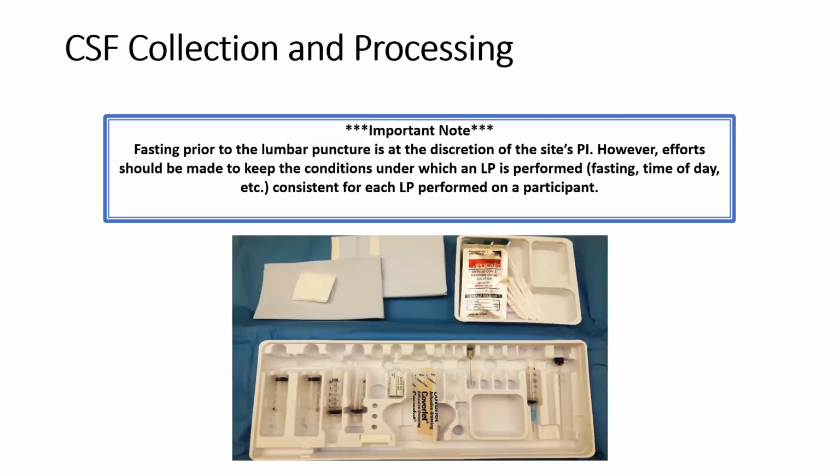For CSF, it's an important note before we get started that fasting prior to the LP is at the discretion of your site's PI. However, it would be great if efforts could be made to keep the conditions under which the LP is performed, like fasting and time of day, consistent for each LP performed on the participant. So every time point they come in to collect CSF, just keep those variables the same.